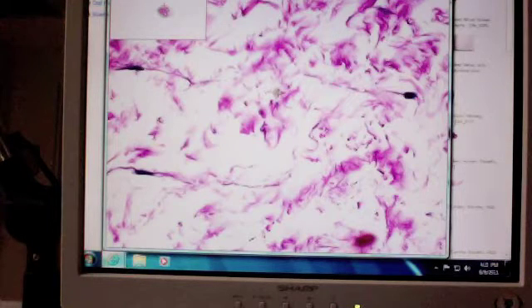It is embryonic tissue, it is also mucous connective tissue, but remember this, what does this also look like? Loose connective tissue, okay, so in an exam I'm not going to ask you to guess what this is. I'll say, in this umbilicus, what is this tissue? Mucous connective tissue.